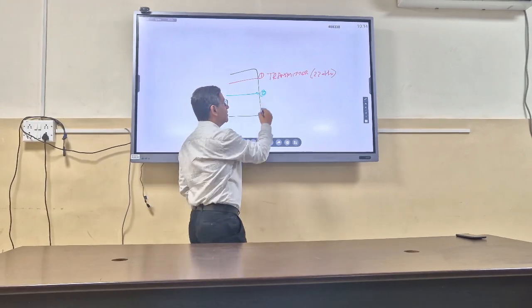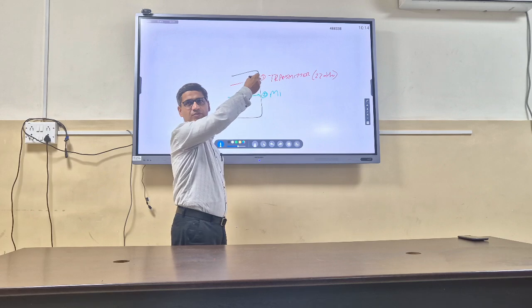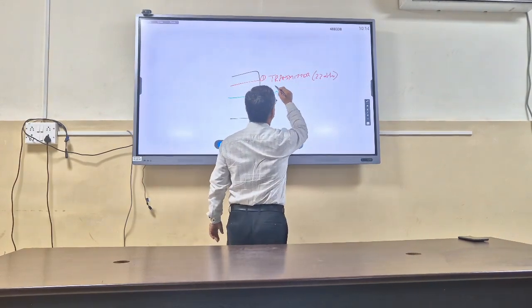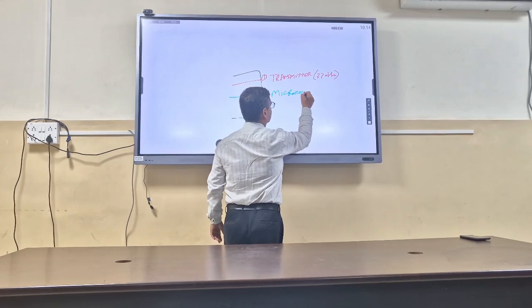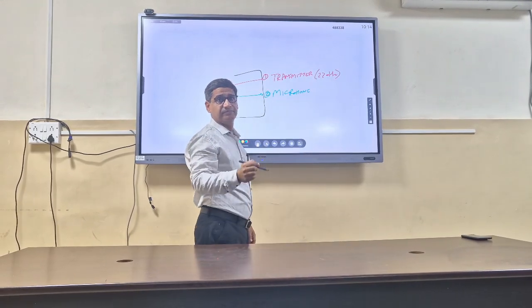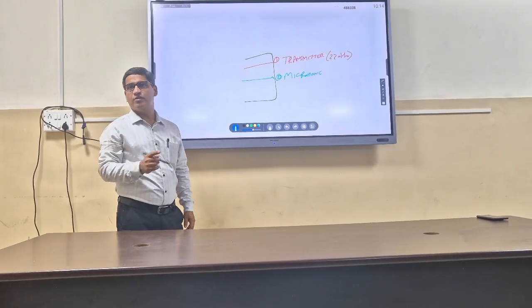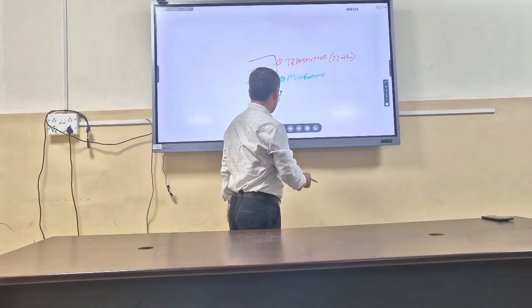The first one is the transmitter, or oscillator.